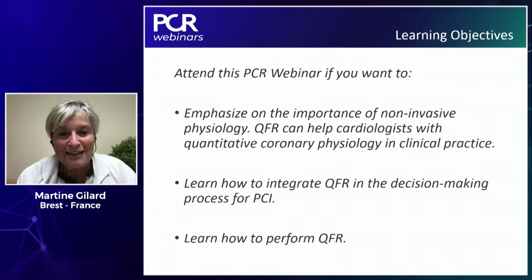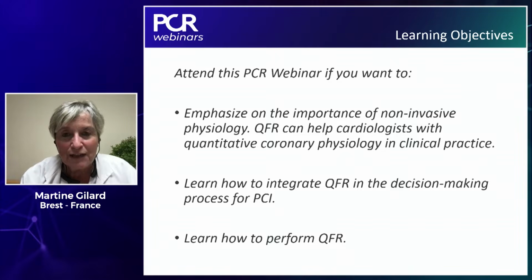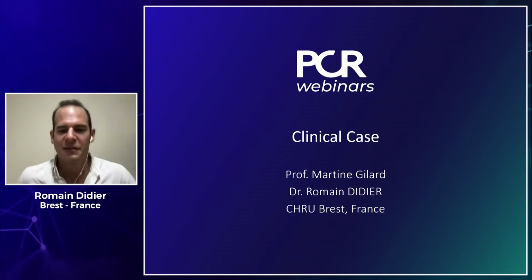First of all, we recorded a case in Brest, and Romain Didier will present the case and the recorded video of the case. So thank you, Martin. It's a real pleasure to share with all of you the cases that we initially recorded. So we go through the case directly.